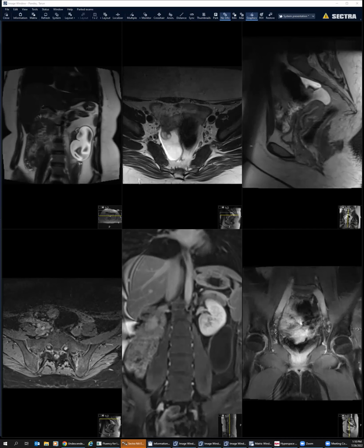So what I was saying is that the fact that there are cystic areas around these ovaries, it's also possible that there are adhesions and there are some inclusion cysts. So that's our working diagnosis right now.